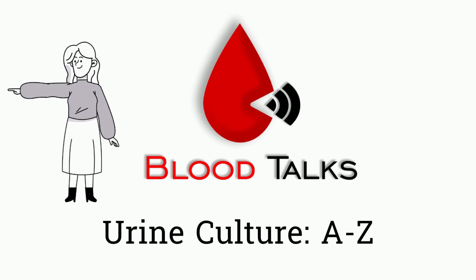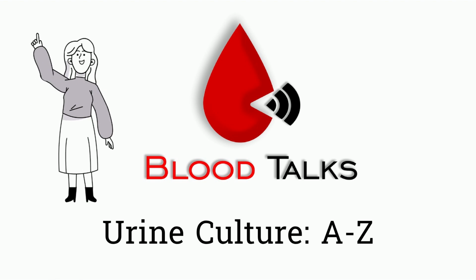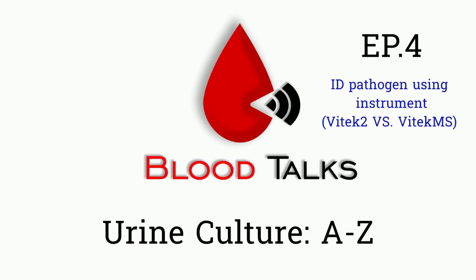We talked about specimen collection, transportation, and ID using traditional methods already. Today we'll be talking about identification using microbiology instruments. This is more of how we ID organisms in clinical laboratories nowadays. Without further ado, let's get into it.